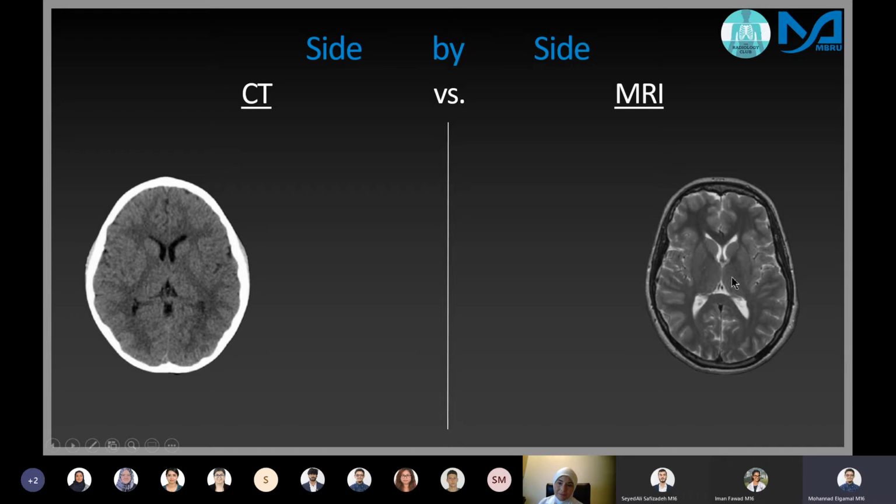This MRI, sorry, on the right. I'll just say it. It's a T2. It's T2, but it's fat suppressed. So you can see that the fat is suppressed around the skin, doesn't seem as bright. So it's fat suppressed T2 or a STIR T2.